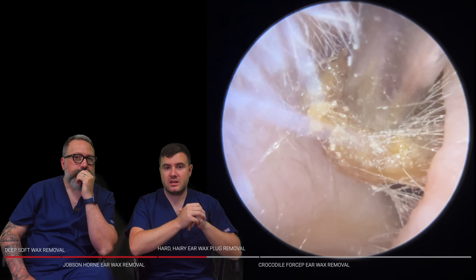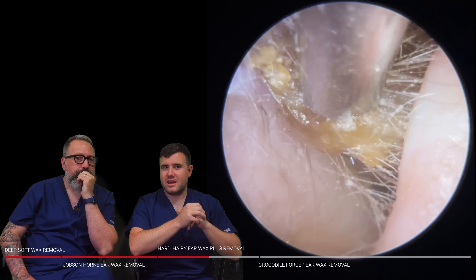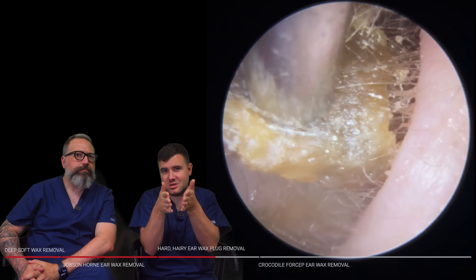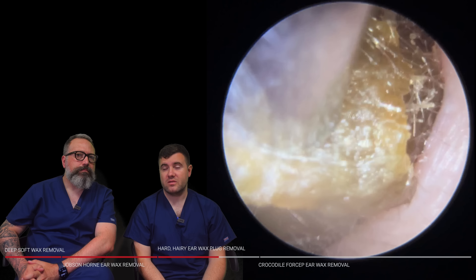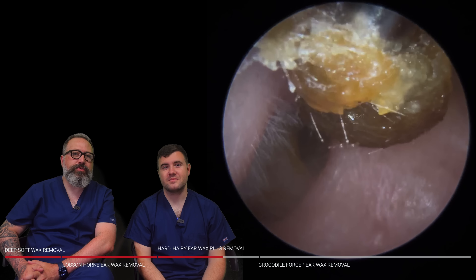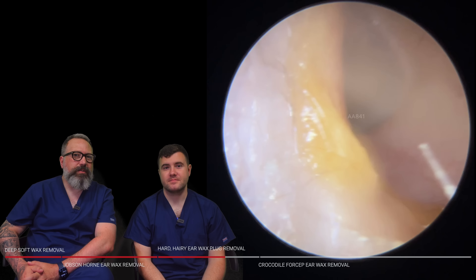Little tiny spots. Oh, that's a nice big chunky piece that one — let's have a little look. There's quite a bit there down in that recess as well, by the looks of it. I'm having to drop to one side here just to be able to get the angle I need to get the tube down. That's a good piece coming out of the recess there.